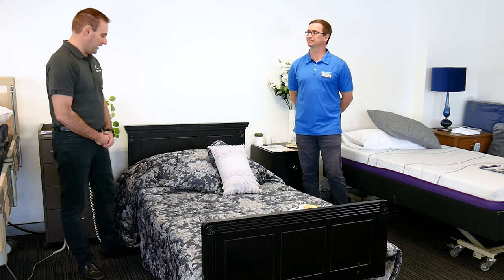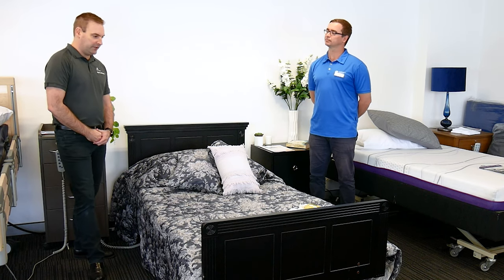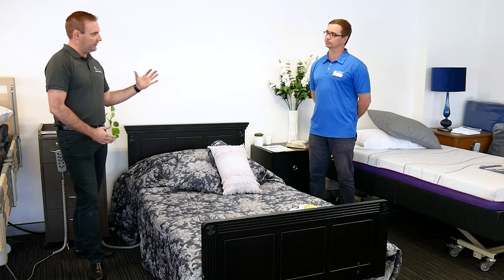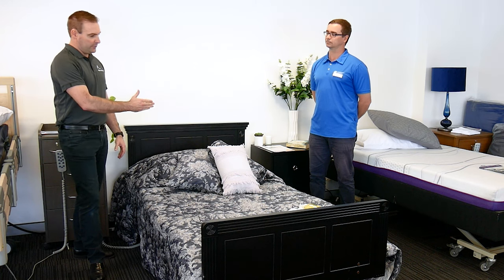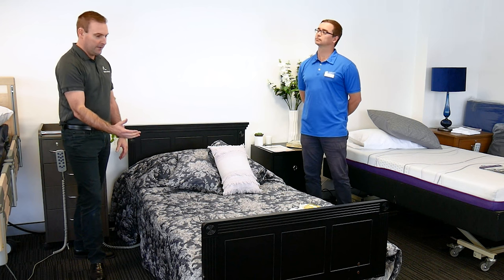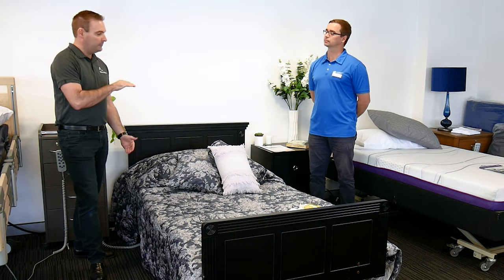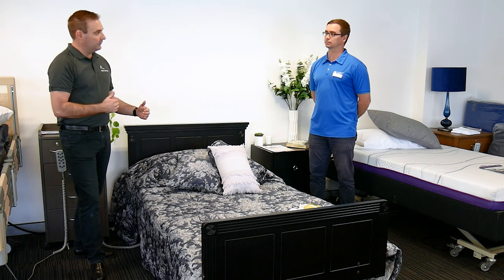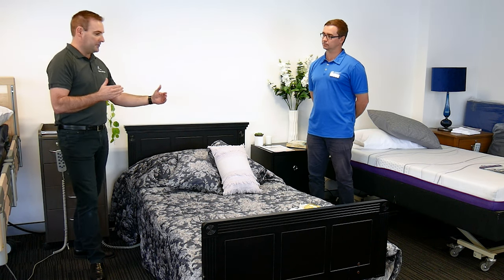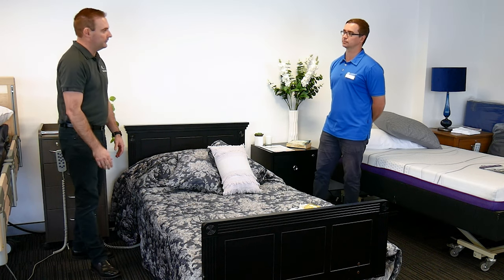Thanks Scott. So this is our EuroCare floor line electric height adjustable bed. It is a four-section bed with the electric backrest, the knee break, the upper leg, and the lower leg has got a vascular support option. This bed does go down to 100mm and goes up to 800mm. It can also come in single and king single widths. It has a built-in length extension on both beds and it also has central locking casters.